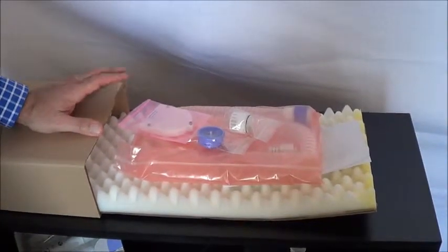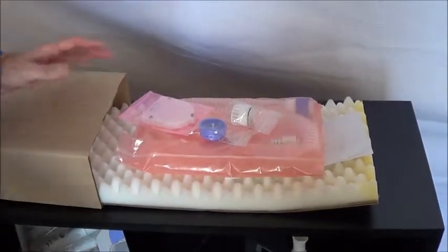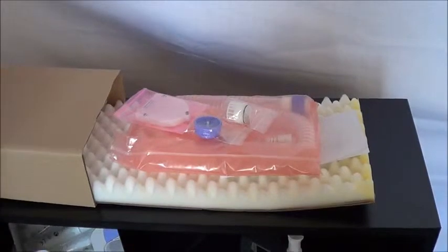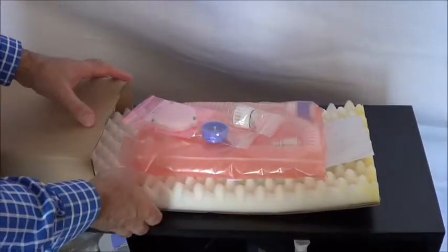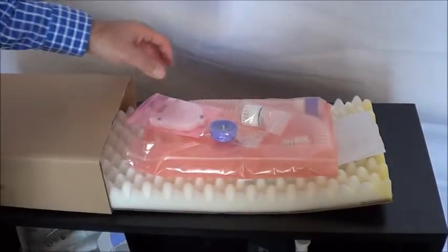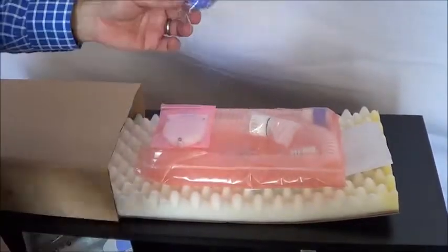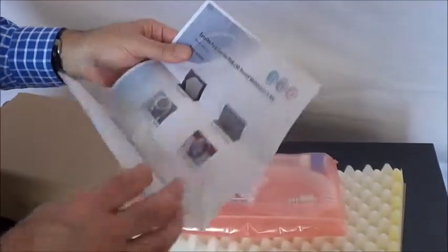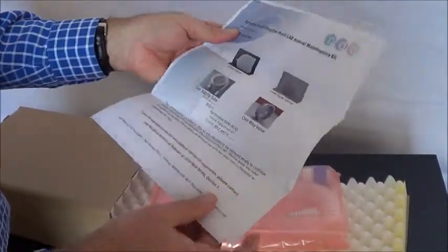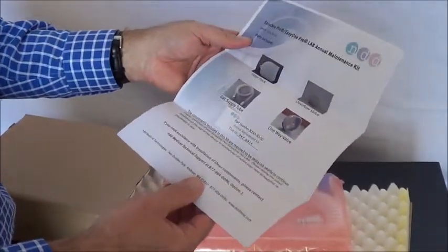This video is about the replacement of the parts that are required annually on the Easy One Pro. The Easy One Pro requires very little maintenance, but one of the things you must do annually is replace these parts. When you purchase the kit from us, it comes with four parts: a filter pack, a one-way valve, an overpressure valve, and a patient tube. The box also includes an instruction sheet and a label to put on the rear of the device to remind you in a year that you need to replace these parts again.